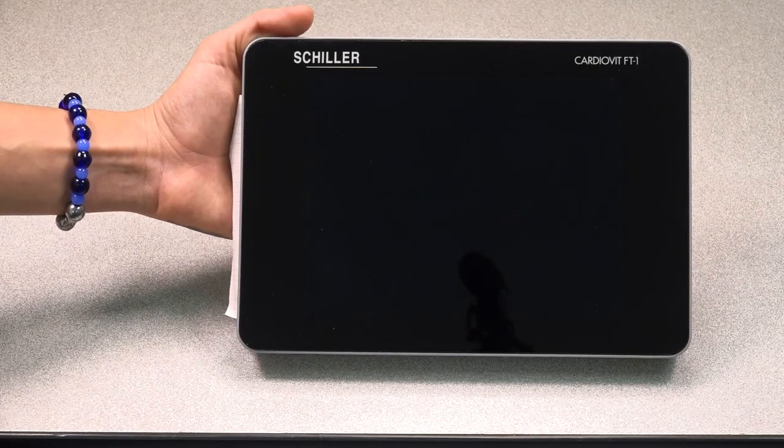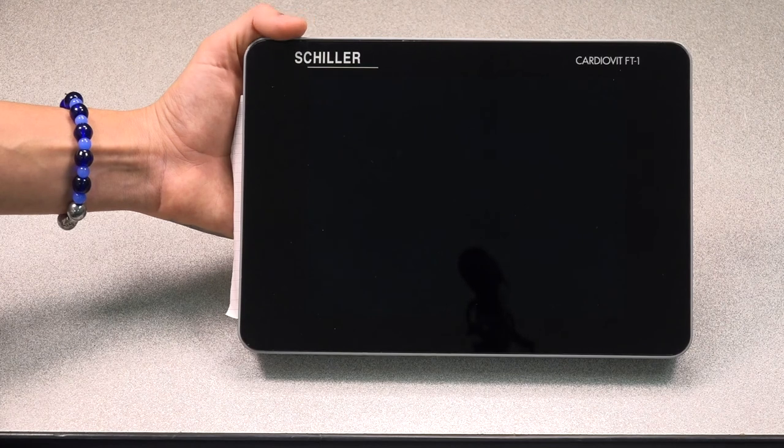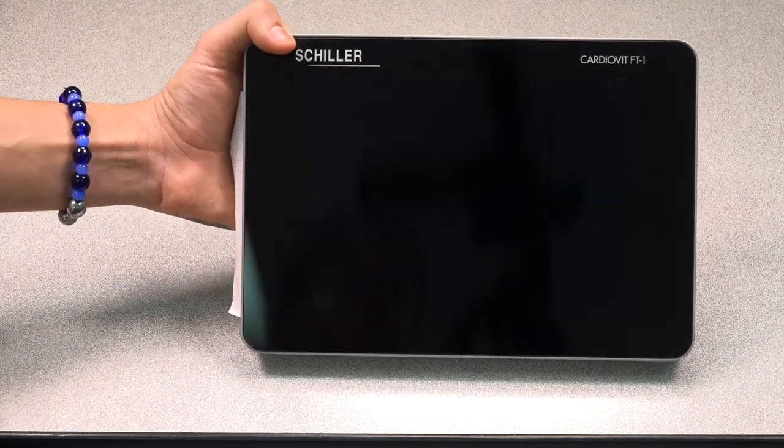In this video, we'd like to demonstrate the basic functions of the CardioVid FT1.